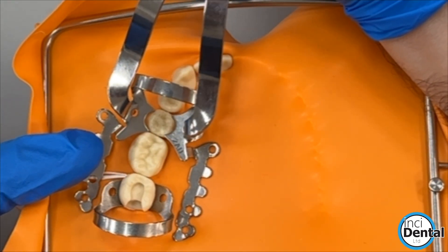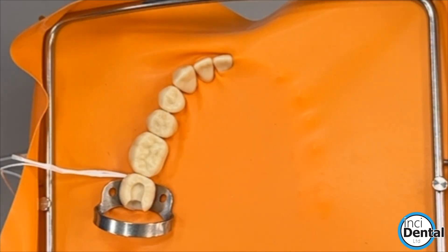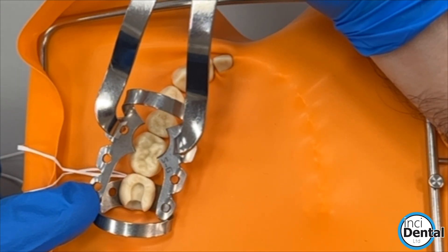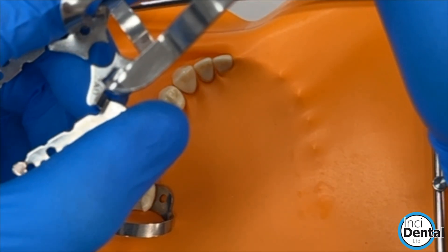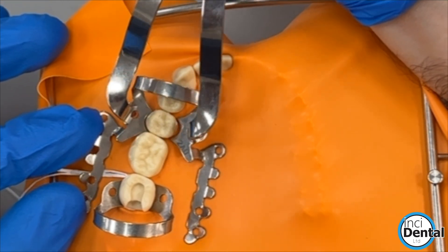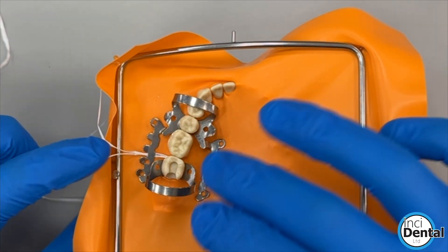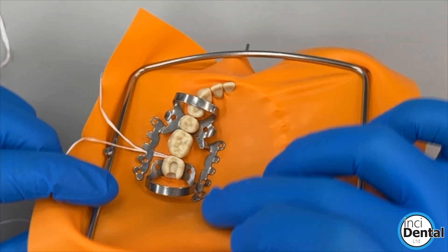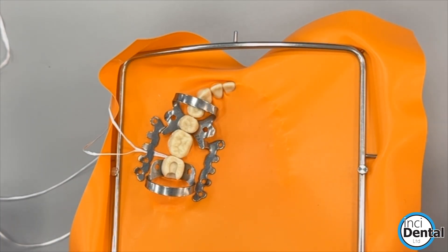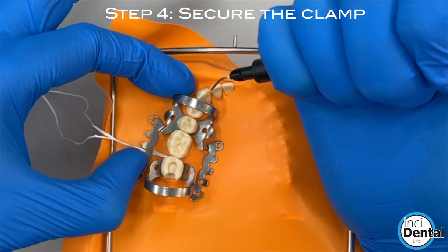You can come from the 5 or the 4, and if you need to come off the molar, then you could use the SG clamp. Come over the 5 and sit it. In the mouth, this area is going to want to come up, so it's worth stabilising this clamp with some liquid resin. Press the clamp down to make sure it's secured.